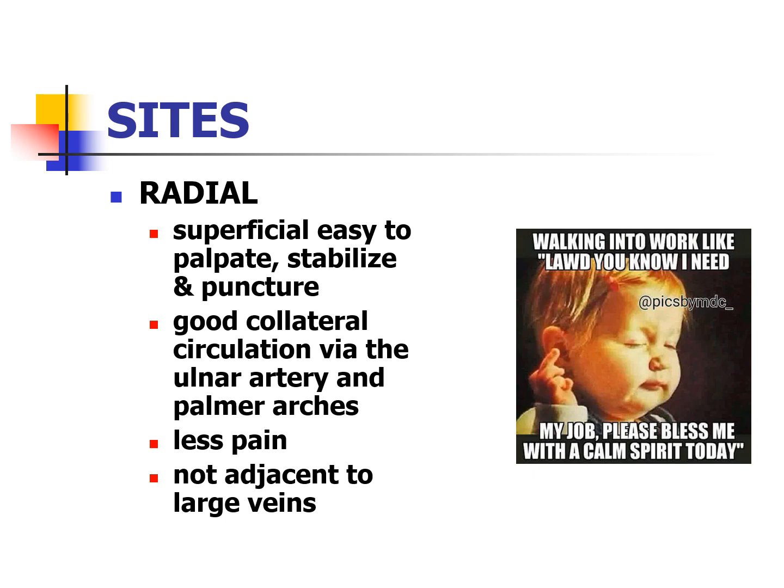The other thing here, it has good collateral circulation via the ulnar artery. There's a lot less pain in this situation because it's more superficial. There's a lot less nerves in the radial site compared to like deeper in the elbow or in the femoral, of course. So a lot less pain with the radial site as well. It's not adjacent to any large veins like you have with your elbow, and especially your great saph that's in your leg that's next to your femoral. So you have a lot of advantages with the radial site. So you should remember these. It's an important slide.